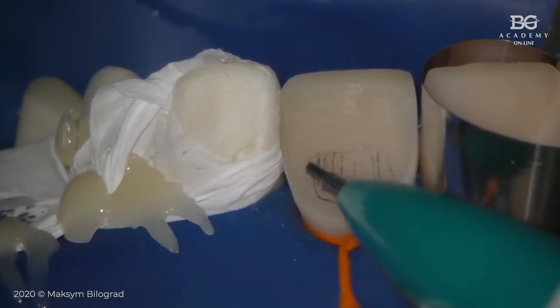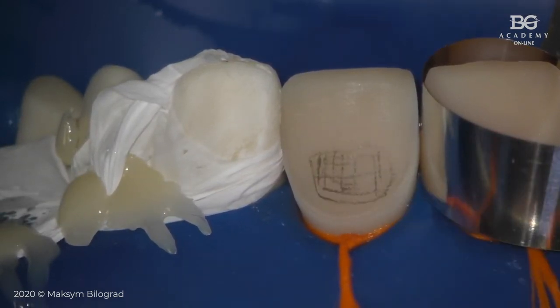Okay, this is filling. This is IDS and big filling there. Okay, composite, because there was a caries defect, for example. So what I will do in this case, so now let us forget everything that I did before. So we just have these two at the very beginning. And I will do this thing.